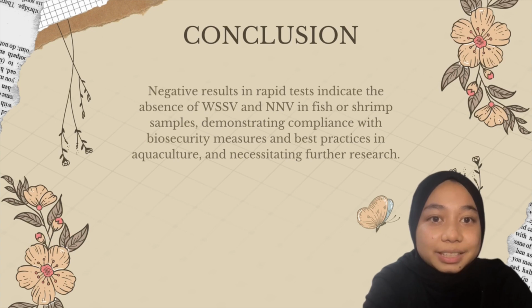In conclusion, the negative results in rapid tests indicate the absence of WSSV and NNV in fish or shrimp samples, demonstrating compliance with biosecurity measures and best practice in aquaculture, and necessitating further research.